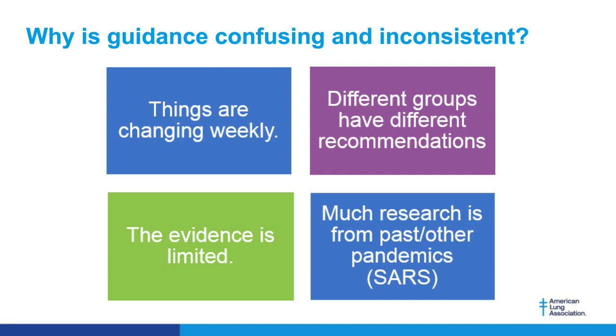Even the CDC has made some of the decisions labeling many of the techniques and procedures that we do in the pulmonary function lab as aerosol generating. There's no real good science, and even the CDC suggests that that's probably true. The evidence is very limited.